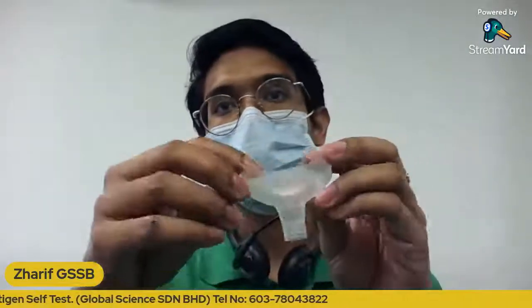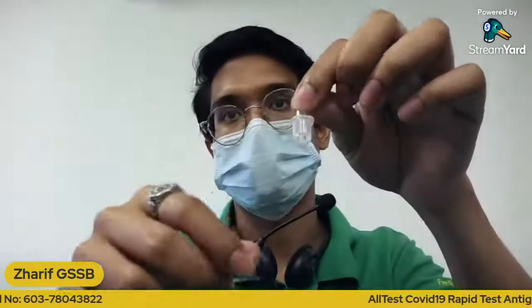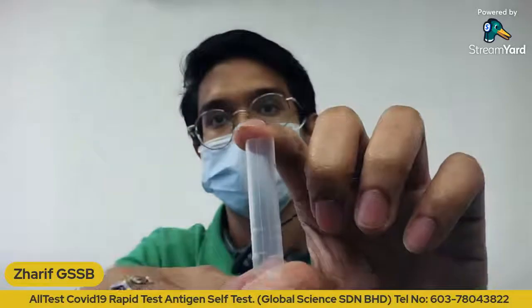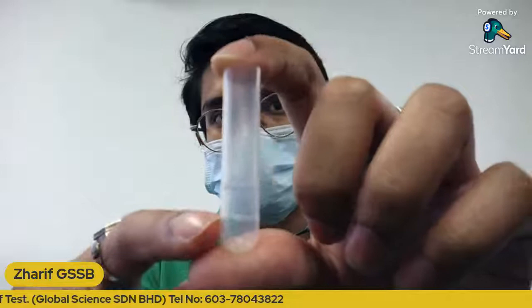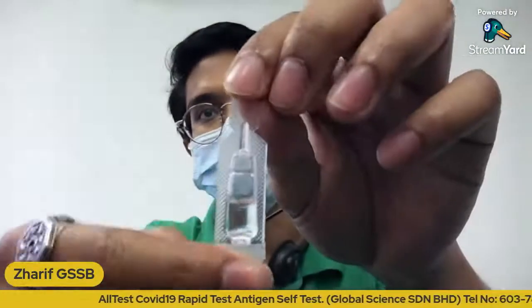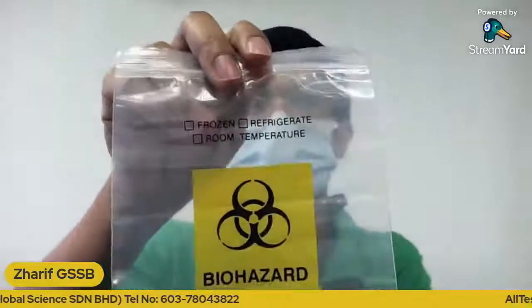Third is the funnel. Fourth is the tube cap. Fifth is the tube, which, if you notice, has two scales on it. The first one marks 0.5 milliliter and the second one marks 1 milliliter. The sixth is the buffer. And lastly is the biohazard bag.